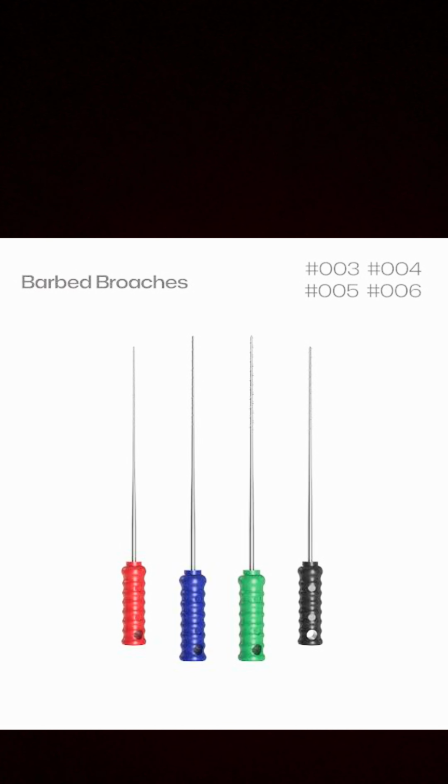Broaches break easily, especially if they bind in the root canal. To avoid binding and breakage, many clinicians avoid the use of broaches and initiate root canal exploration and instrumentation with a size 08 or 10 K file. Next one is K-type reamer and files.